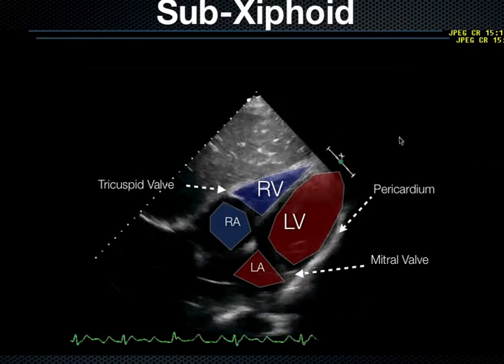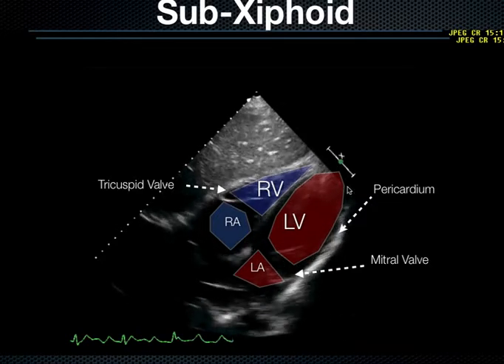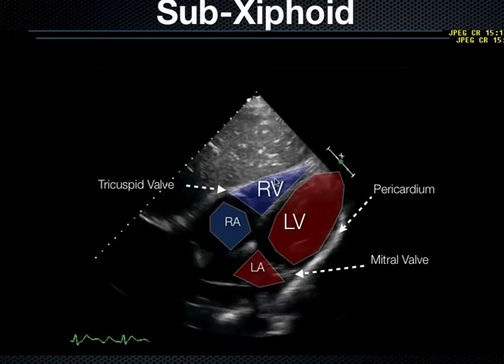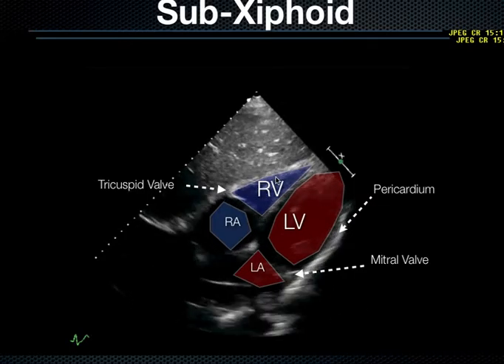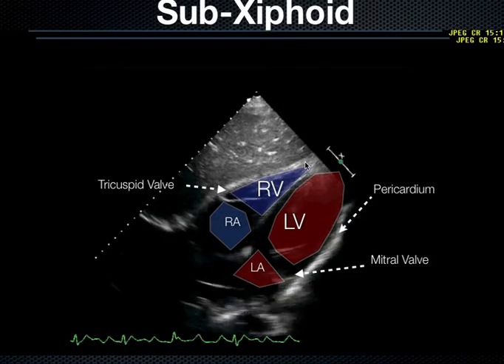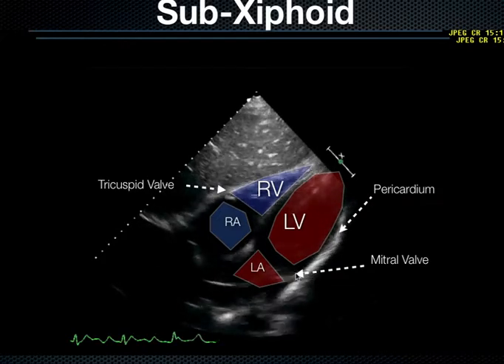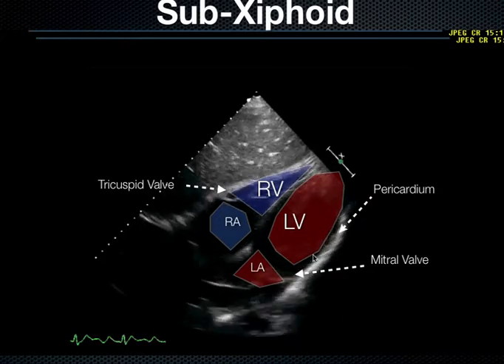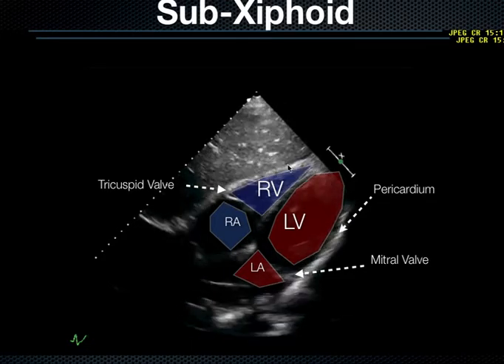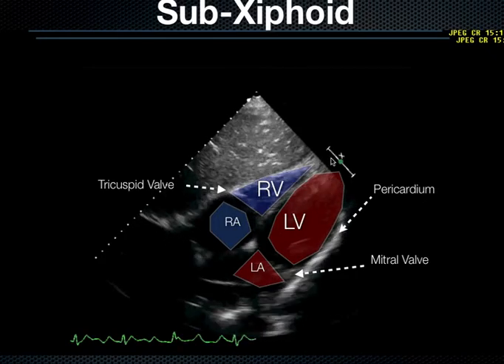The second thing I use this for is for pericardial effusions. This is the best view, the most sensitive view, to check for somebody having a pericardial effusion, or fluid between the myocardium and the pericardium. You see, in a supine patient or somebody lying flat, the heart is heavy, and it sits in its posterior pericardium, squishing any fluid anteriorly. And so this is exactly where you see these pericardial effusions, right along this anterior area.